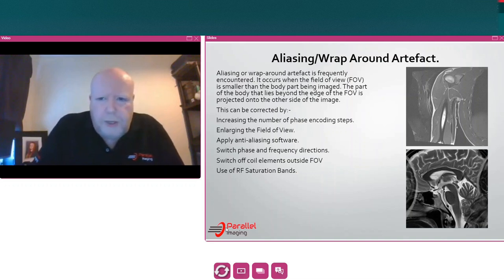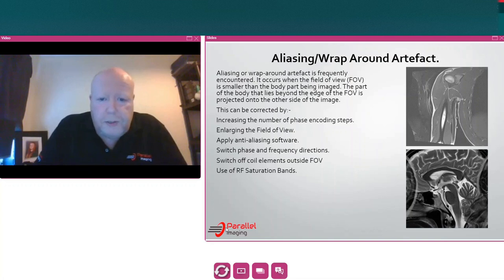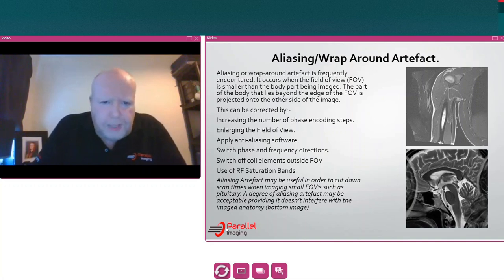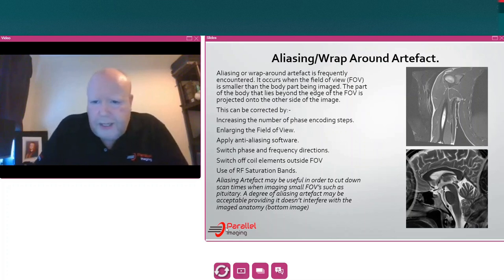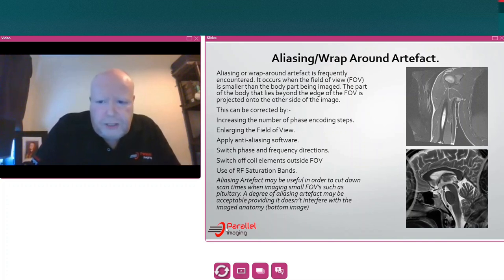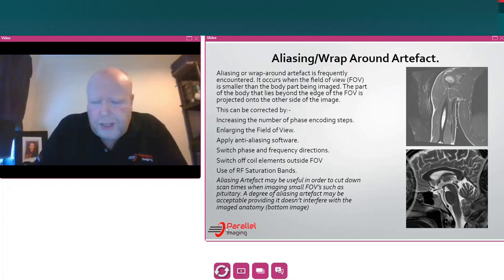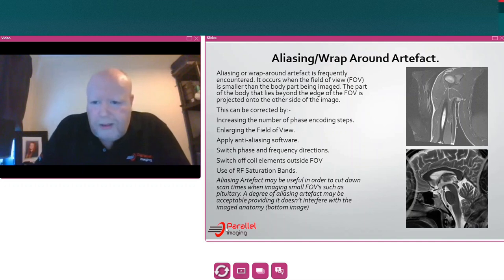Use of RF saturation bands can also help, though remember that using extra RF sat bands increases the SAR burden on the patient. However, aliasing artefact can sometimes be useful — for small field of view imaging such as the pituitary, introducing this wrap into the image can maintain a decent clinical scan time. This technique can save about one and a half to two minutes of scanning time. Please make sure your radiologist is happy with this approach, but sometimes aliasing artefact can be our friend.